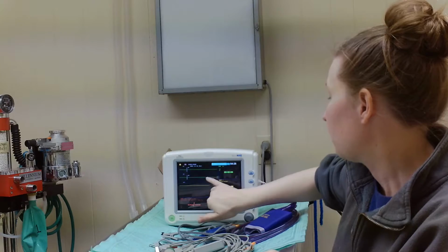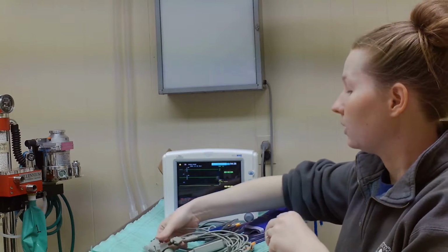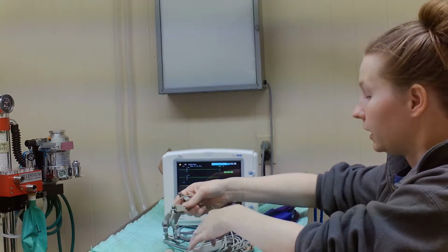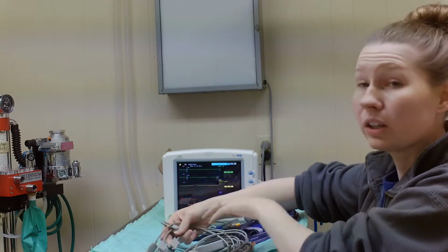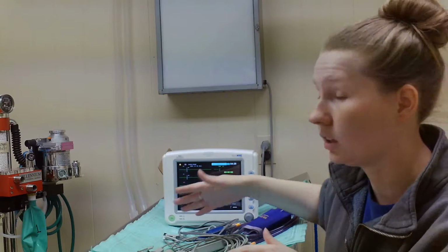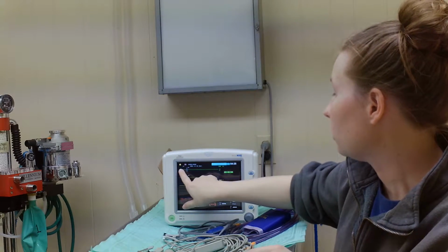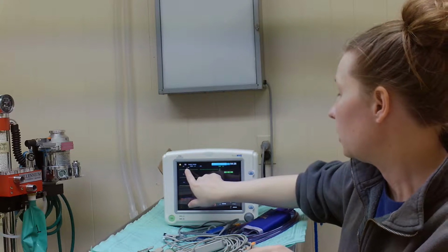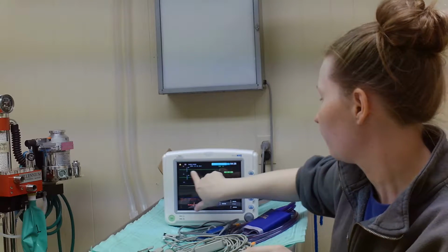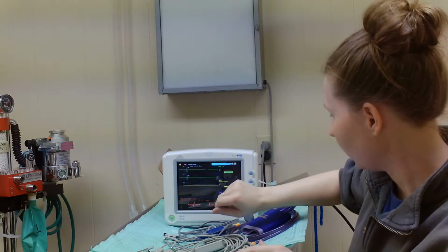EKG would be these top lines. If I had the EKG hooked up, that would be the one with the different leads. Like I said, this is a 5-lead hookup, but we only use 3. Typically you can use 4 in a veterinary office, but we only use 3 today. It would give you the normal P, Q, R, S waves and all of that through these 2 lines, and it would give you your heart rate right here in this green.